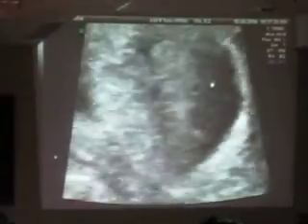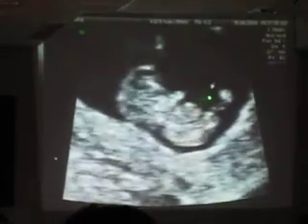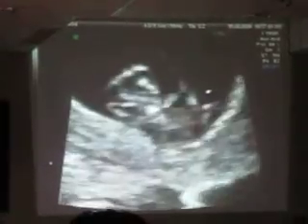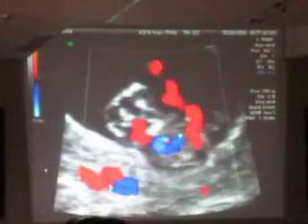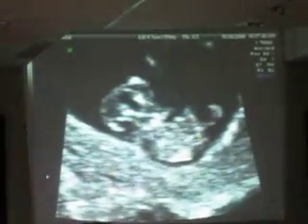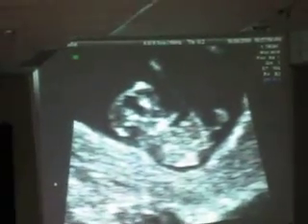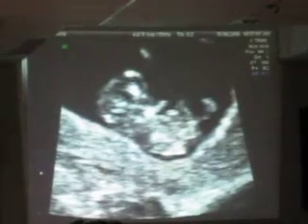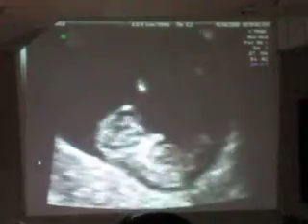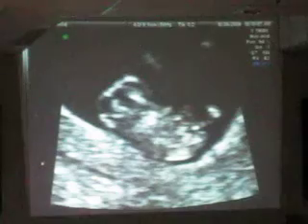In this, the omphalocele, sometimes we see physiological herniation. Suppose we see pulsations there? Yes, you will see pulsations there. Can you switch on color, please? You are seeing the pulsation there. Now take out the color. You will always see pulsations there because that's where the umbilical cord is coming. The umbilical artery pulsation will be seen there through the umbilicus. So that's not wrong, that's expected. Can we take her off now and ask her to empty the bladder and come out?